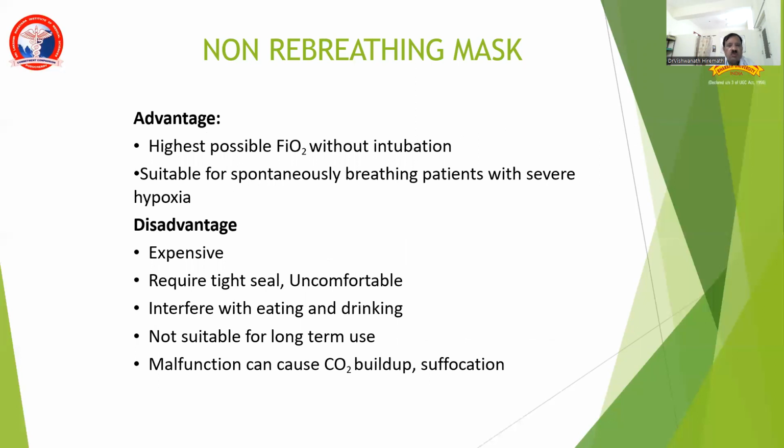Advantages: highest possible FiO2 without intubation. Non-invasively, we can maintain the FiO2. Suitable for a spontaneously breathing patient with severe hypoxia. Disadvantages: expensive, requires a tight seal, uncomfortable, interferes with eating and drinking, not suitable for long-term use. Malfunction can cause CO2 buildup and suffocation.